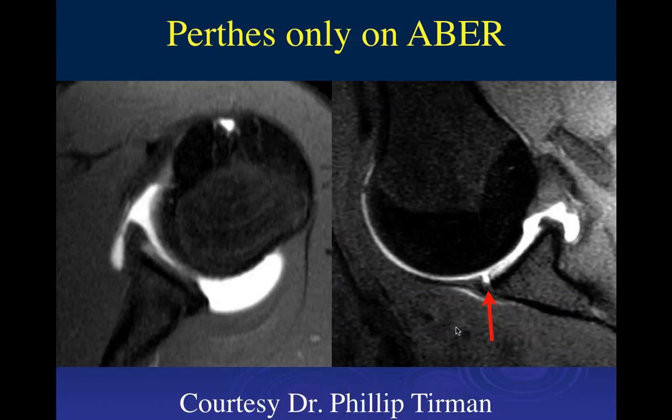So in my experience, doing the ABER view hasn't markedly increased the sensitivity, but you've seen 3 or 4 examples in the lectures where it does increase the sensitivity. We will typically do ABER in the young athletes, but not in the non-athletic population.